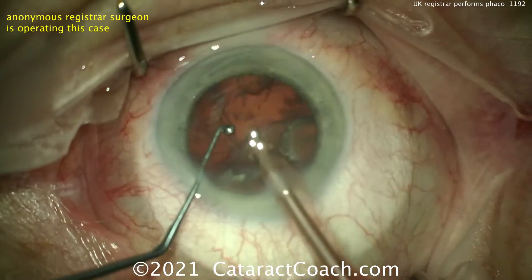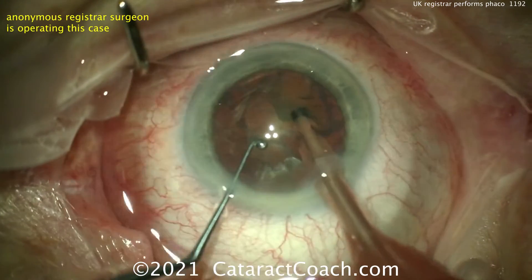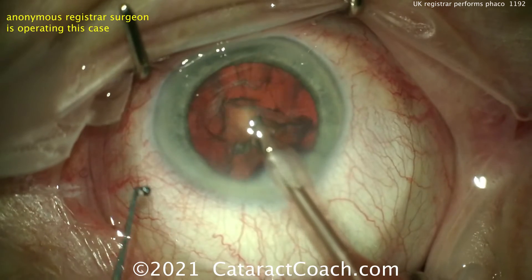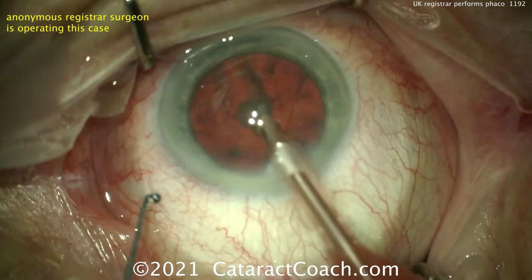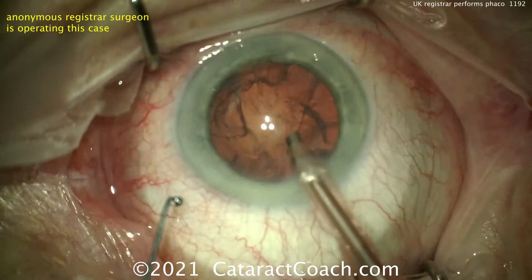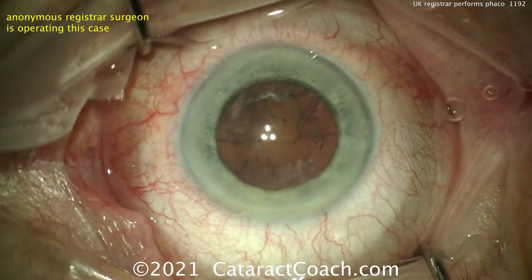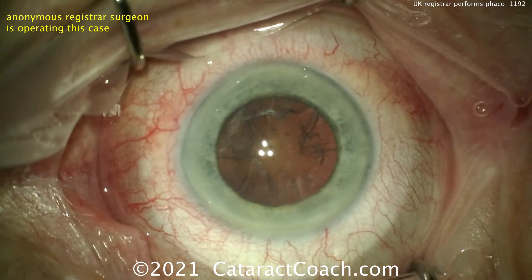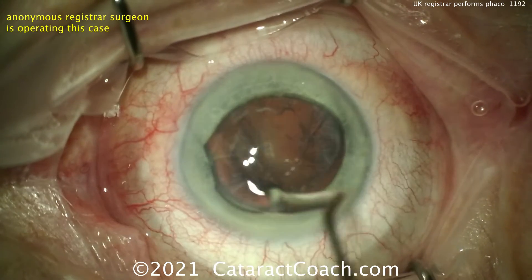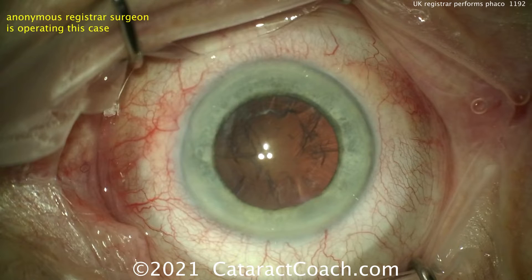And now finally removing the nuclear pieces. So I showed you the whole video unedited — again about eight minutes, which for a doctor in training, for a young registrar, she is doing an amazing job. I would now focus on just perfecting your technique, just the little things. Work on that incision a little bit more. The rhexis is good, but I bet you could make it great. You're obviously a very talented young doctor with great hands, and you have the drive and determination to become better, because that's why you sent the video in. You really care.